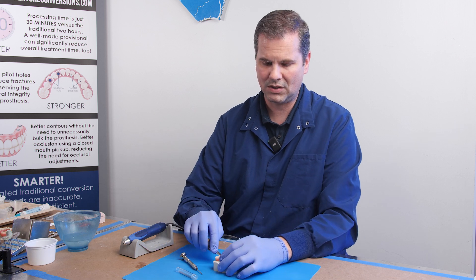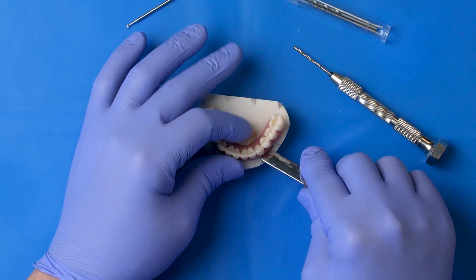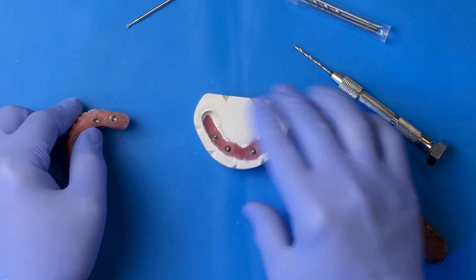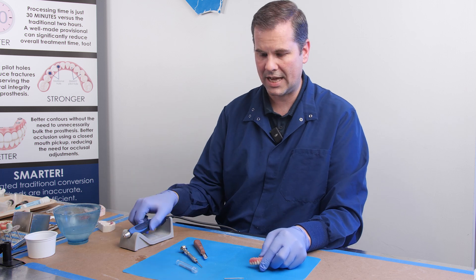We're going to get underneath the prosthesis, and just like we did in the mouth, we're going to twist it just a little bit, and it pops right off. I'm going to set this to the side because I no longer need that.